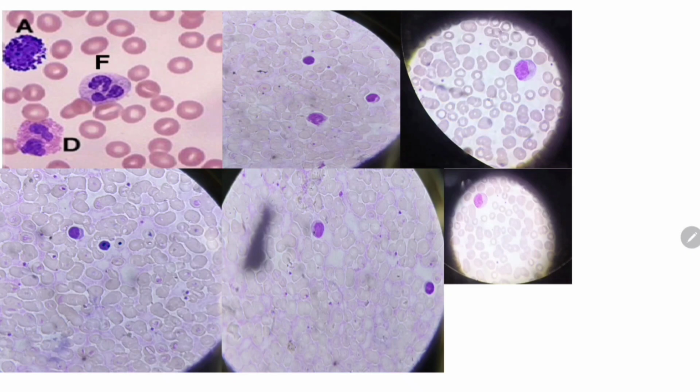So this is a small lymphocyte and this is the size of an RBC. These are overlapping RBCs maybe, and this is a large lymphocyte. The cytoplasm, around 20% is clear, this is the clear cytoplasm, and this is the nucleus at around 80%. Yes, this is the large lymphocyte and this is the small lymphocyte. Here we will stop. Monocyte we can show you.